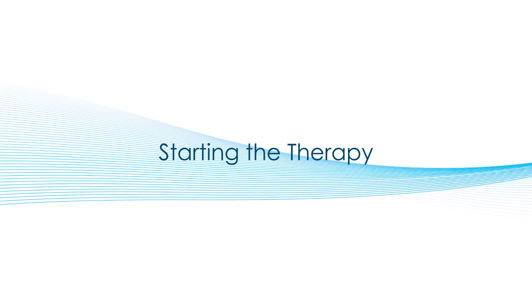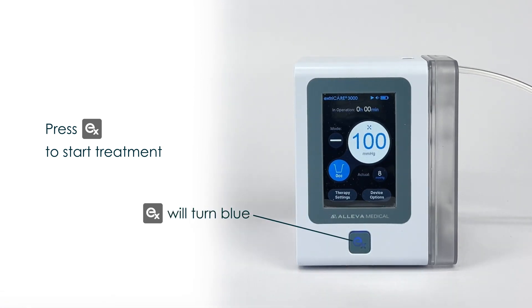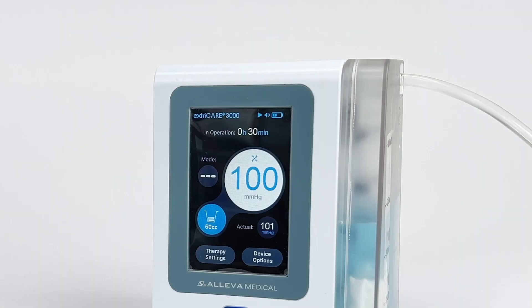Starting the Therapy. Once the pump has been properly set up, start the therapy by pressing the EX button until you hear a beep and the EX button lights up in blue. This signals the therapy has started. The target pressure is shown as the large blue number on the screen. You may notice a fan-shaped symbol flashing on top of the target pressure number — when this symbol appears, the air pump is working to reach its target pressure. Underneath the target pressure is the actual pressure measured in real time. The ExtraCare 3000 has the ability to track usage; the total duration of therapy is displayed above the target pressure, indicating how long the pump has been in use since the last reset.